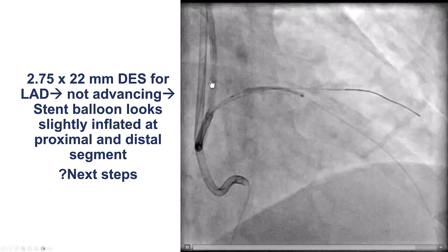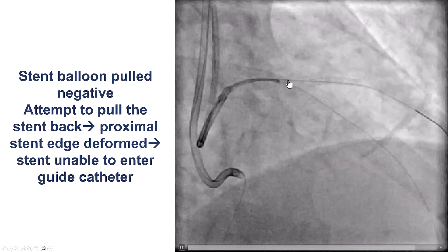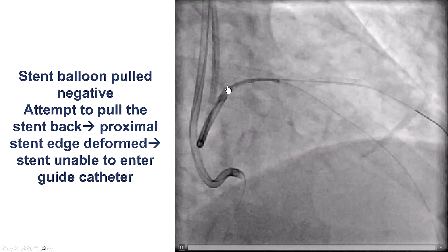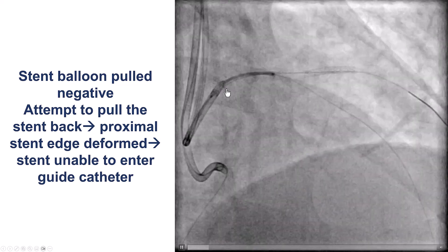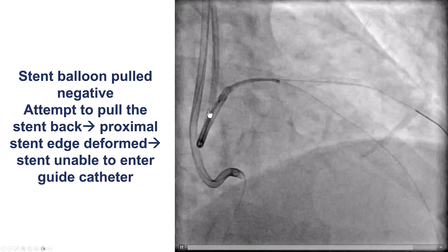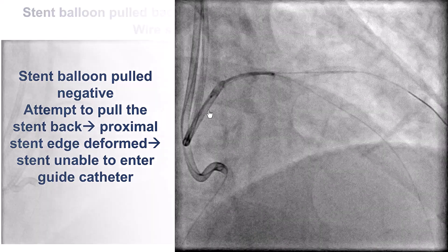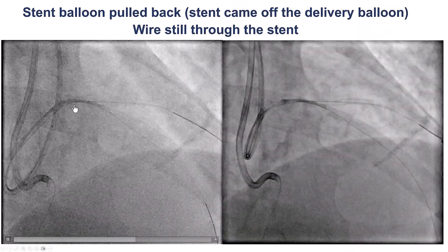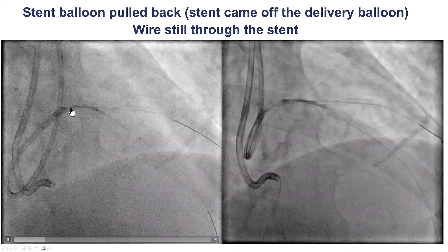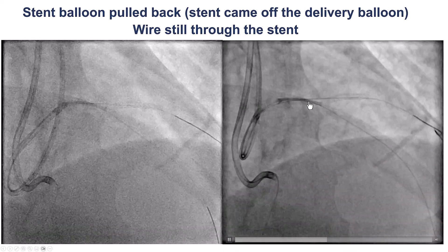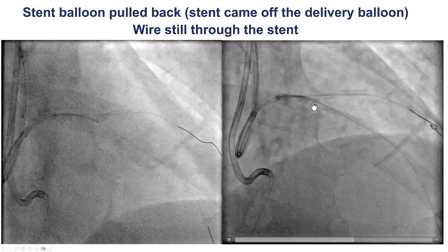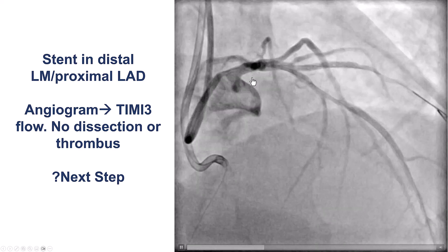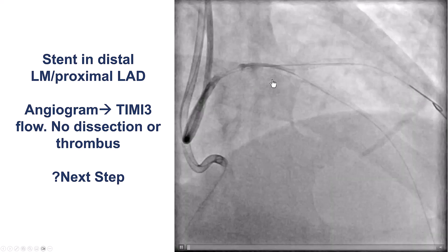What to do next? We cannot deliver it anymore. We tried to pull things back into the guide, but unfortunately the proximal edge of the stent was deformed and we were unable to get it back into the guide catheter. As we kept pulling, the balloon of the stent came back, but the stent remained in the left main — sticking out from the left main into the LAD. Fortunately, there was good flow and we did not compromise flow into the vessel.